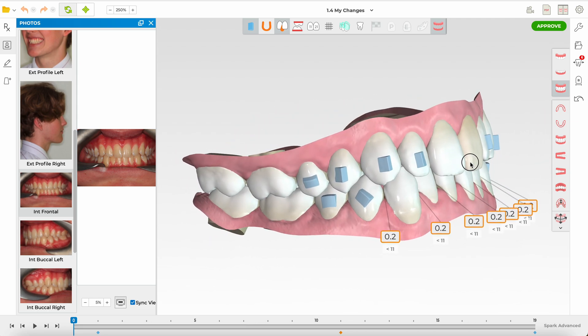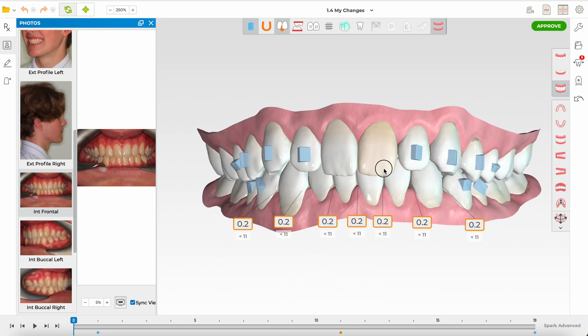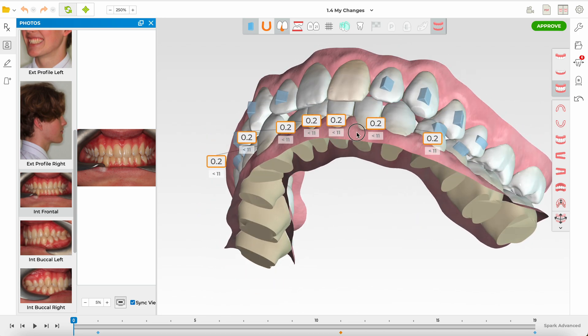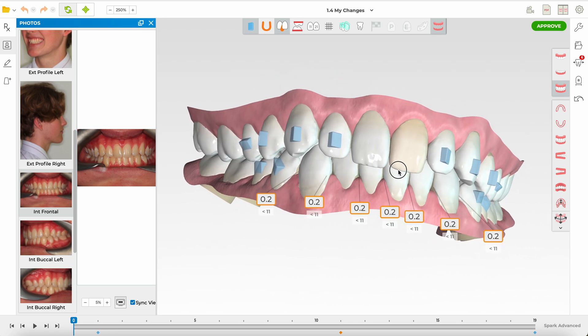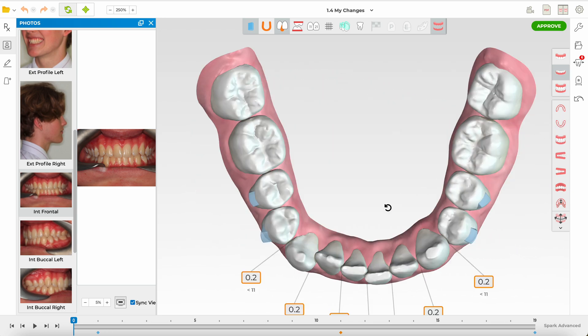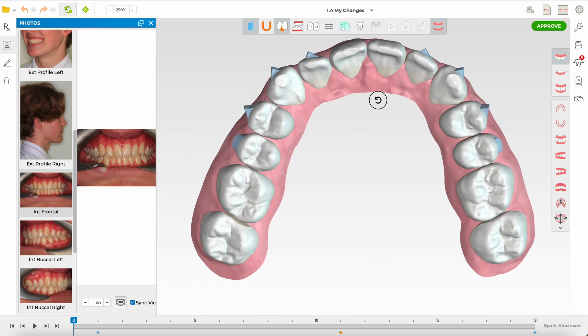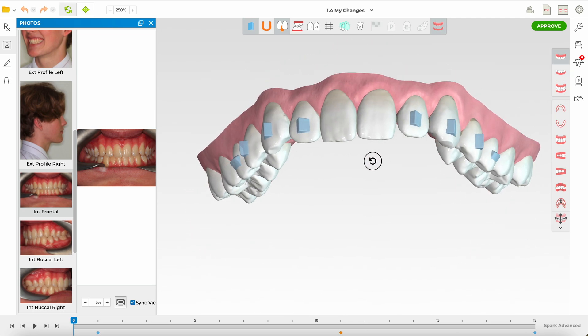It's a Class I occlusion on both sides, midlines coincident, nice overjet, and nice overbite — in fact this is about as ideal an occlusion as we can get. In the lower arch there is mild crowding and possibly some clenching or wear facets on the canines, along with some mild crowding.